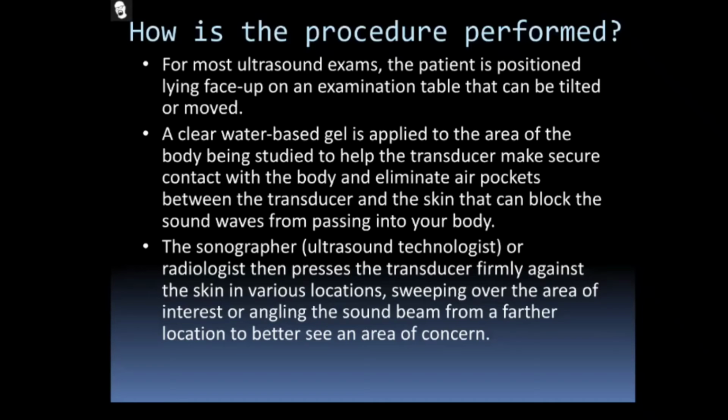Ultrasound technicians are called sonographers. The sonographer or the radiologist presses the transducer firmly against the skin in various locations, sweeping over the area of interest or angling the sound beam from a different location to better see an area of concern.